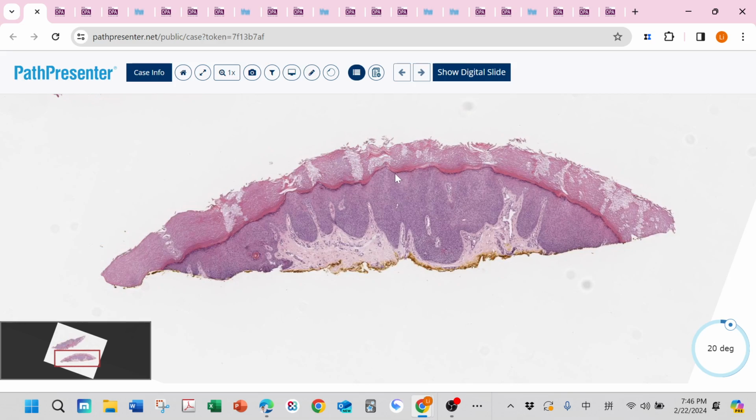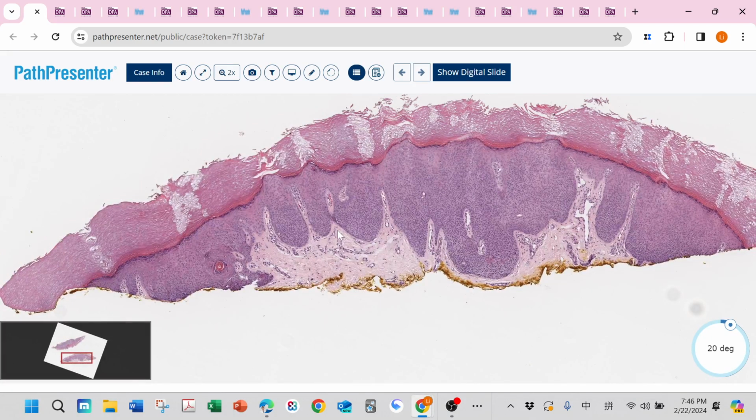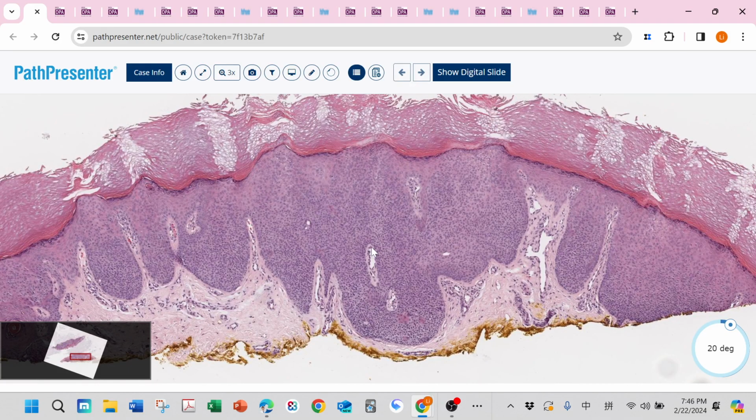see this epidermis with acanthosis, thickening of the epidermis. You may even see this pseudohorn cyst structure, but there is some structure usually not seen in seborrheic keratosis. That is what we call poroma stroma. That is a hyalinizing stroma with dilated blood vessels. So this is really characteristic for poroma.